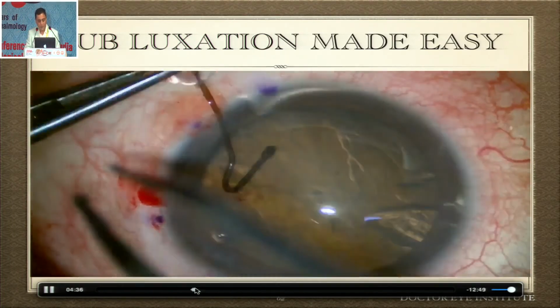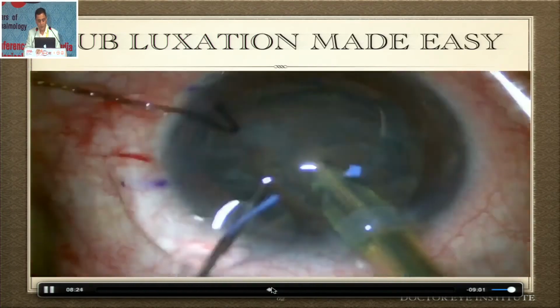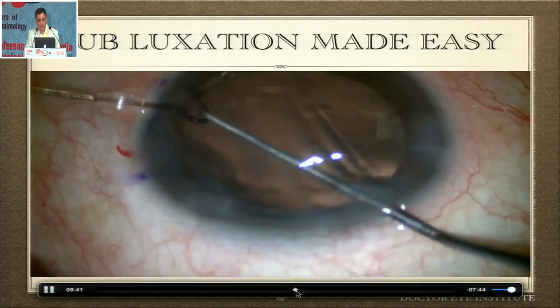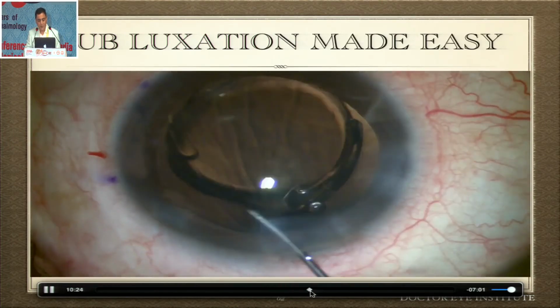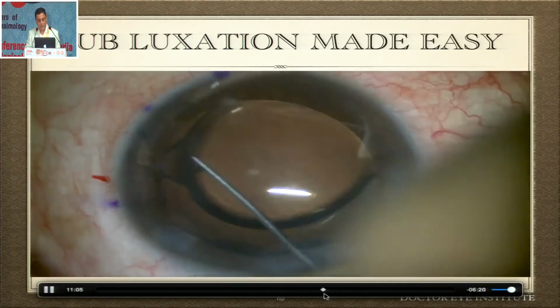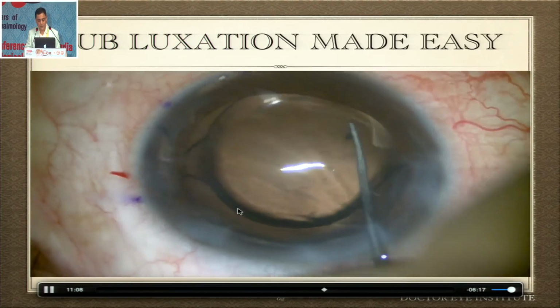I'm putting the endocapsular ring again in position. I'm trying to support there with the capsular hook. Not able to do that, forget that. I'm going ahead and doing phaco, then doing a bimanual IA. Once the bimanual IA is done, I'm doing IOL placement in the bag, again with the direction of the placement in the same area of subluxation. Okay, so this is the area of subluxation.